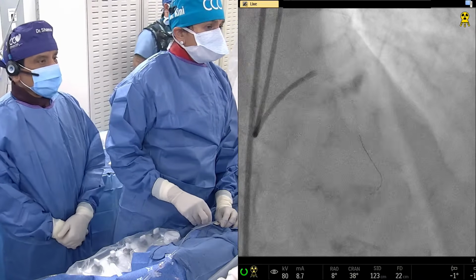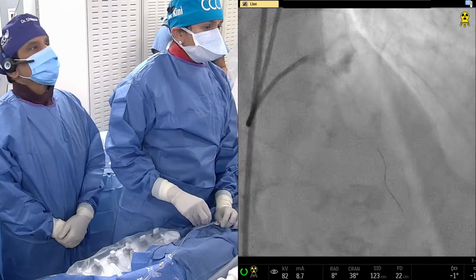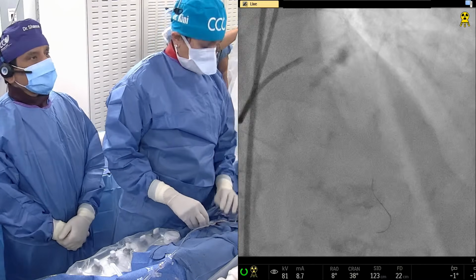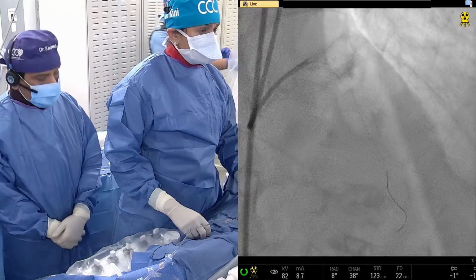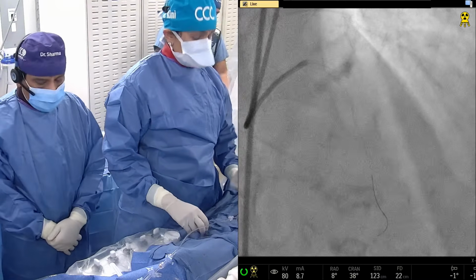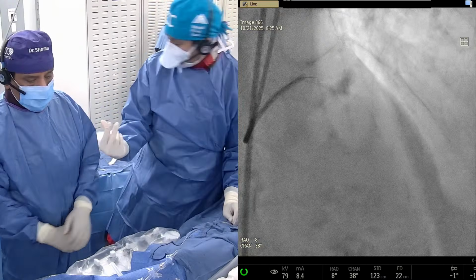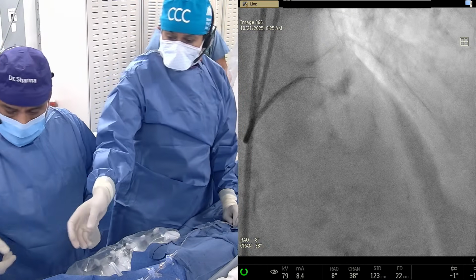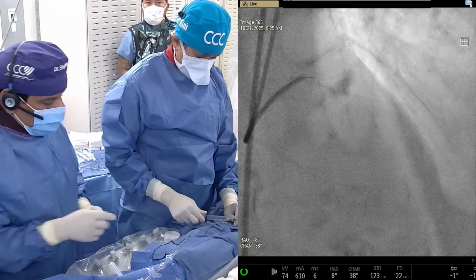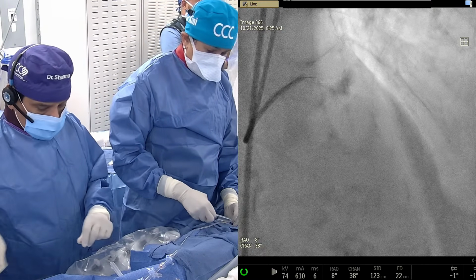Looks to be significant disease even in the ostium, no? Or very proximal. And very tortuous distal LAD. And this, I'm sure, although this is a tight lesion, but compared to some other which I mentioned, you can barely see it on the angiogram. And now you're going to do IVUS of the LAD or diagonal? Diagonal later.